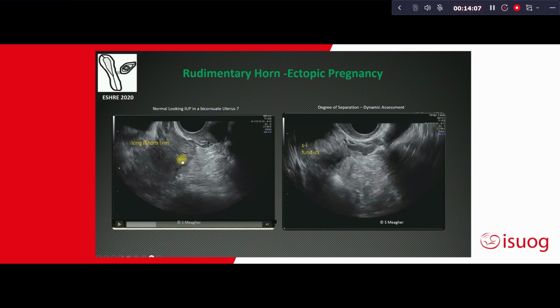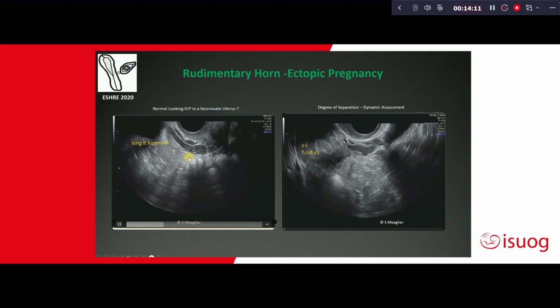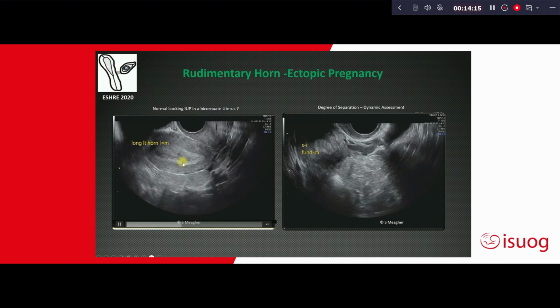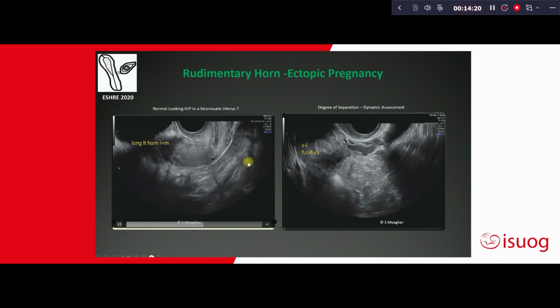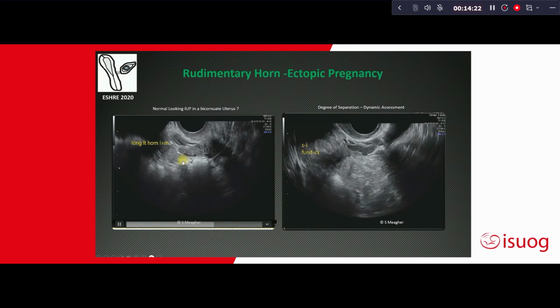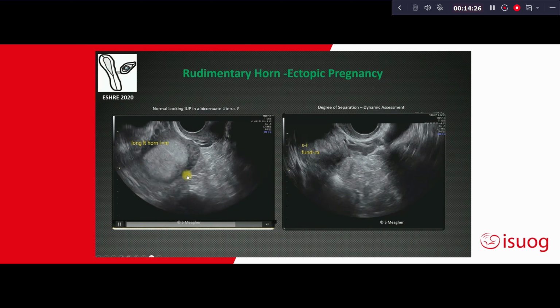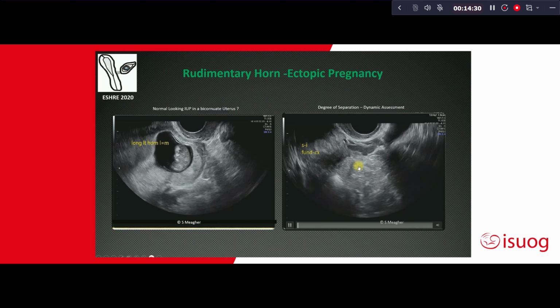As we sweep across the uterine body and pregnancy disappears, and we come across to the midline, and now the cervix comes into view, and here we have the uterine body. Again, to distinguish that the cervix is not actually connected to this gestation sac, to this uterine body, can be extremely challenging.